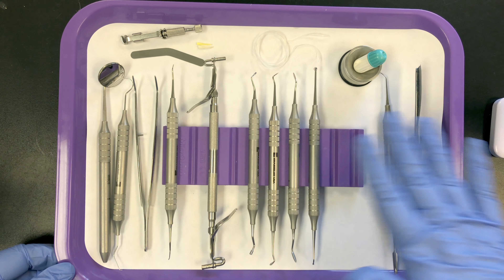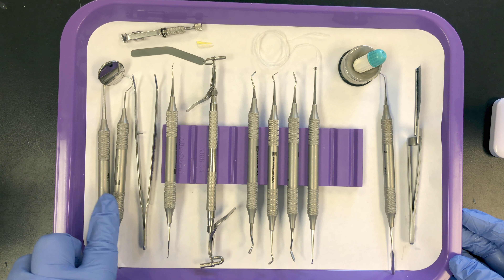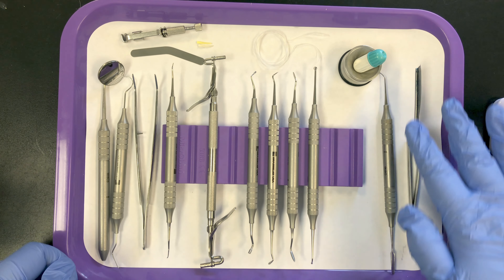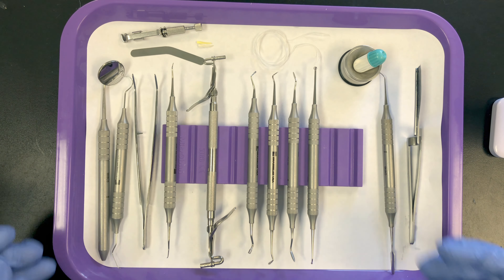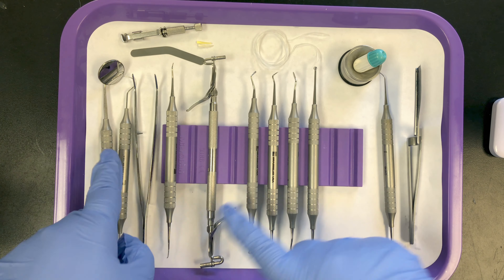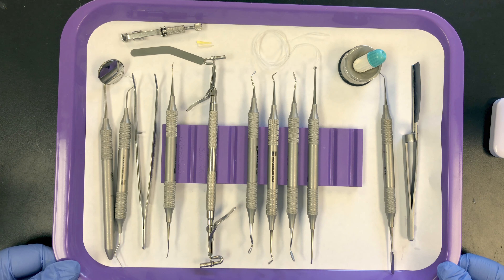So this is a basic amalgam setup: examination instruments, hand cutting instrument, restorative instruments, and then accessories along the perimeter. For my students, you'll have to get these in order and you'll get a short quiz — I'll pick up three items, could be anything on the tray, and you'll have to tell me the use of the item. Until next time.